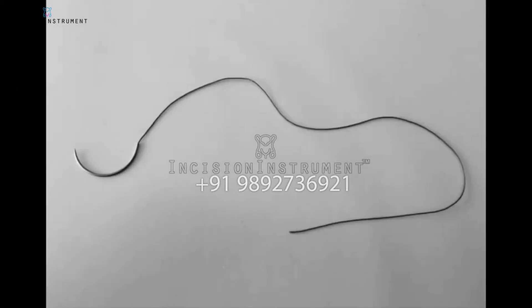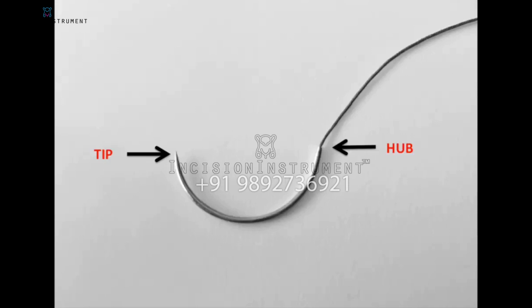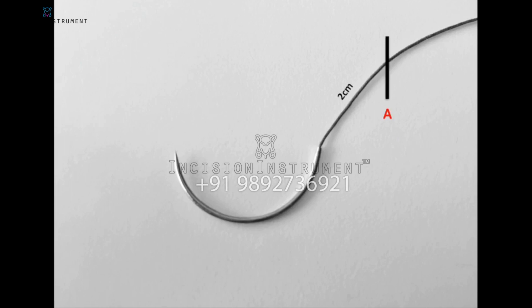Needle anatomy. Throughout this presentation we will be using a CT1 needle connected to 15 centimeters of Vicryl. Each needle has a tip and a hub. We will further divide the needle into three points. Point A will be on the suture approximately two centimeters from the hub — this will be our first grasping point. Point B will be one-third from the tip of the needle — this will be our second grasping point. Lastly, point C, one-third from the hub, will be where our needle driver grasps.